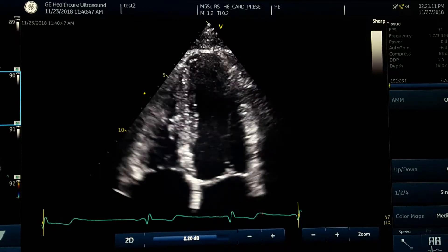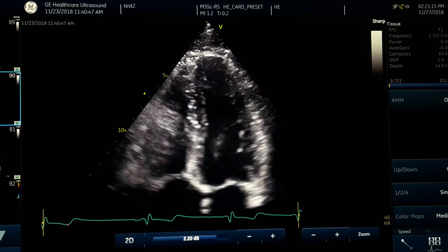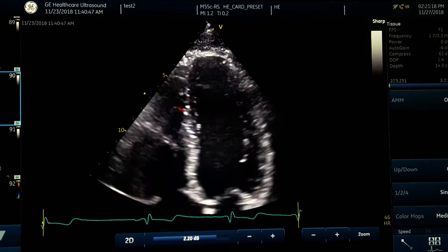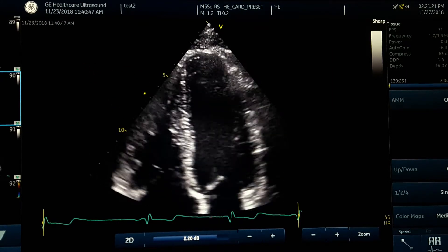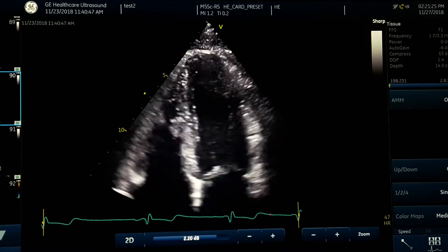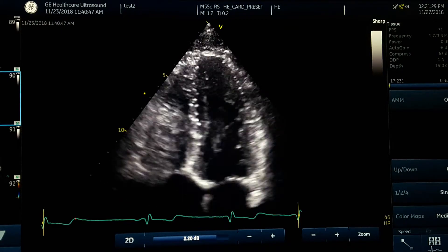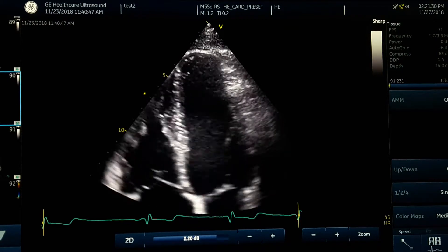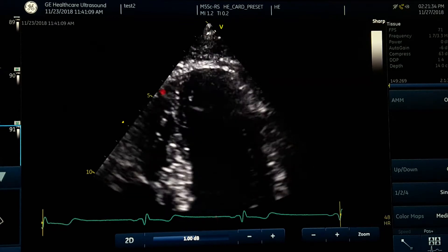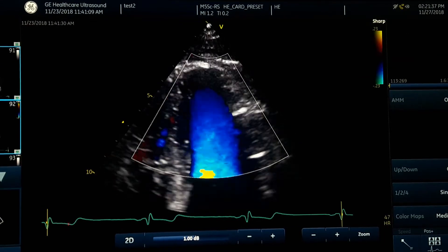After these steps, try changing your angle — go more lateral or medial, and slightly off-axis, anterior or posterior, toward the roof or toward the bed — and see if the finding disappears. After that, zoom in more to see more detail, and then apply color Doppler.